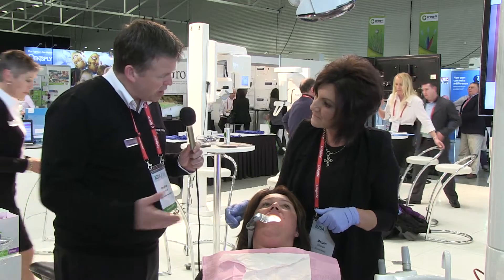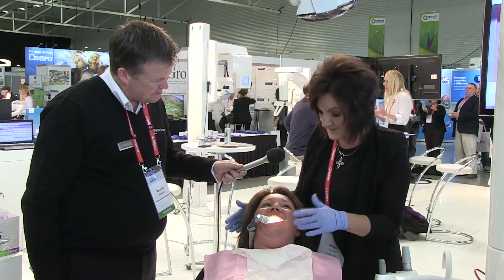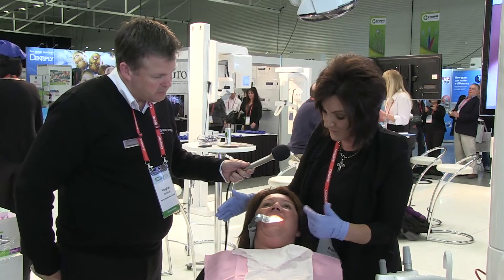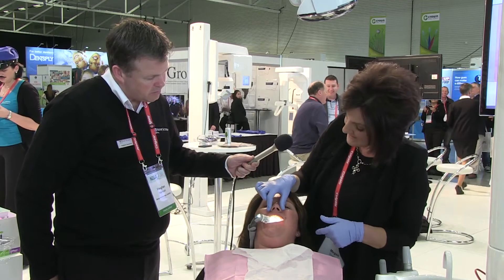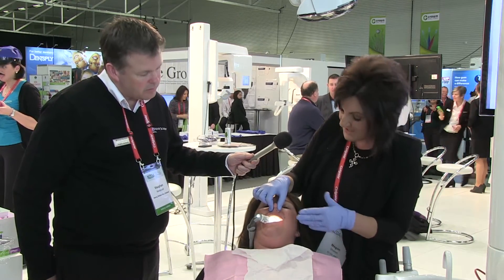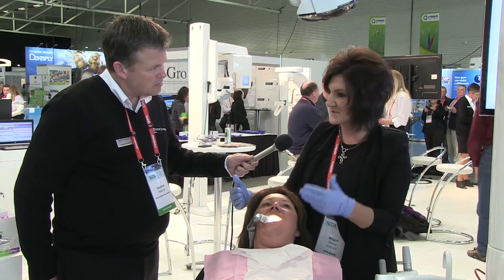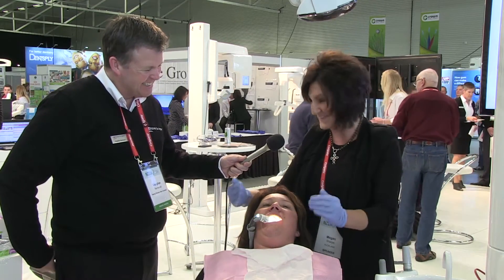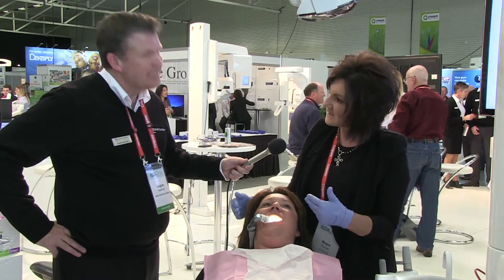Is she still able to breathe normally? Yes, she can breathe. One of the huge concerns is humidity in the mouth and the oral environment — we can manage that using this. If I close Kelly's nose off, she can still breathe through the mouthpiece. She won't be able to talk, but she can communicate if needed. This is also a way of gaining quite a bit of efficiency in procedural time.